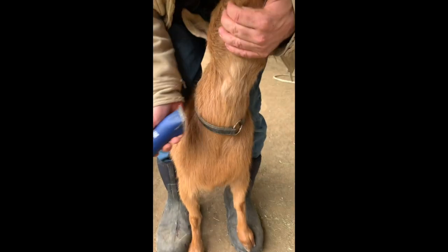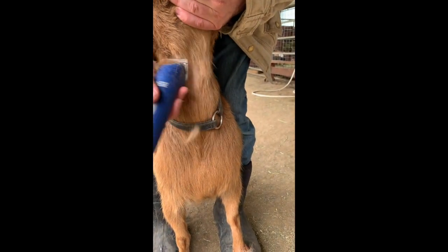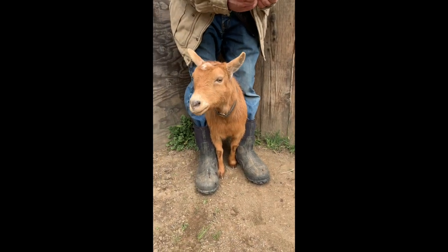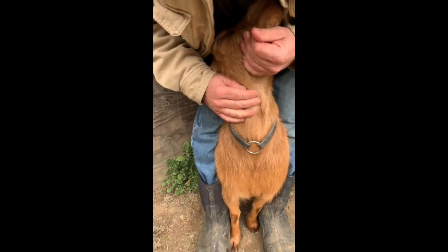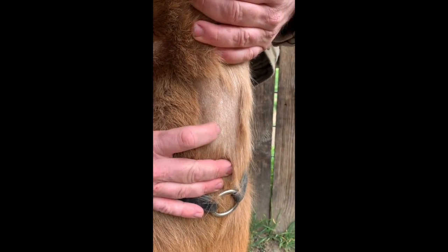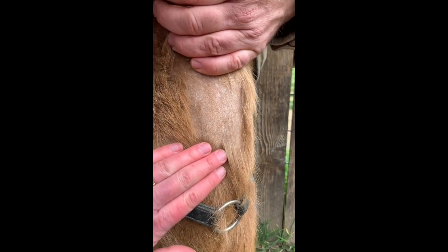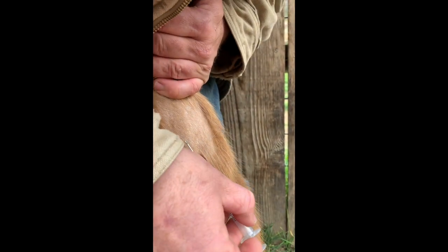To make your life easier we recommend shaving the area around the jugular vein — just a small patch, you don't need to do the whole neck. We like to back our goats up into a corner where they can't scoot away. Now we're going to look for her jugular vein. As you apply pressure you'll see the blood actually fills the vein, and if you have two people it's better so one person can hold down the vein and the other one can collect the blood with the syringe.